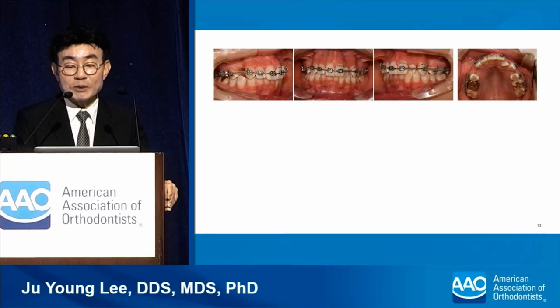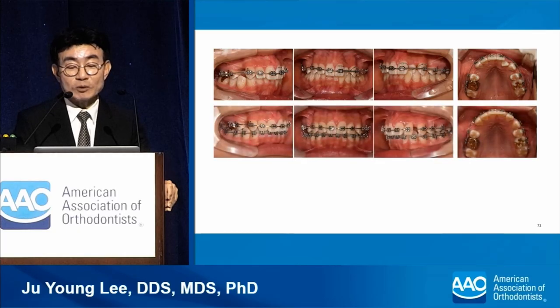An open coil spring was used, but distal movement of the canine was more definite than midline improvement. The midline improvement was not clear even after improvement of lateral incisor crowding.